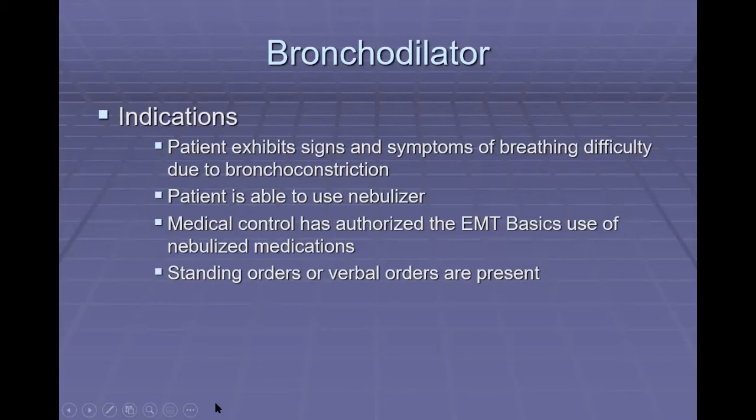The patient is able to use a nebulizer. So if that patient is awake enough to be able to use a nebulizer, we should give them a neb treatment. Medical control has authorized the EMT basic the use of nebulized medication. Now, here in North Dakota, every service has their very own, either their med control or they follow the state's protocol. Whatever your local protocol is for administering nebulized medications, please follow your local protocol. You can also have standing orders or verbal orders that are present. All right, make sure you're following your local protocol, your local guidelines.